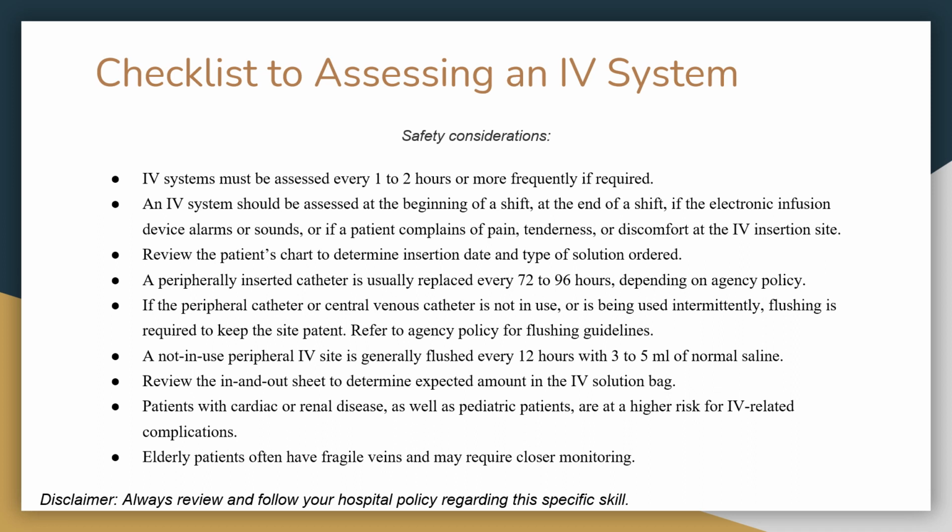Review the in and out sheet to determine the expected amount in the IV solution bag. Patients with cardiac or renal disease, as well as pediatric patients, are at high risk for IV-related complications. Elderly patients often have fragile veins and may require closer monitoring.